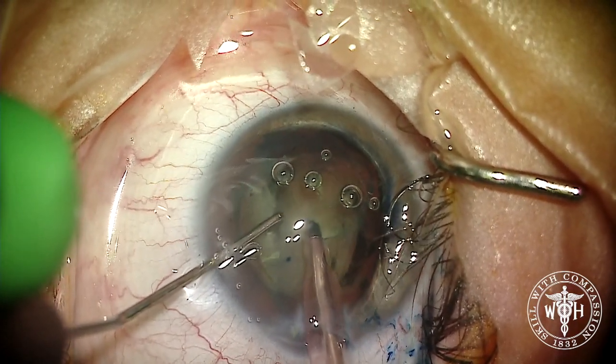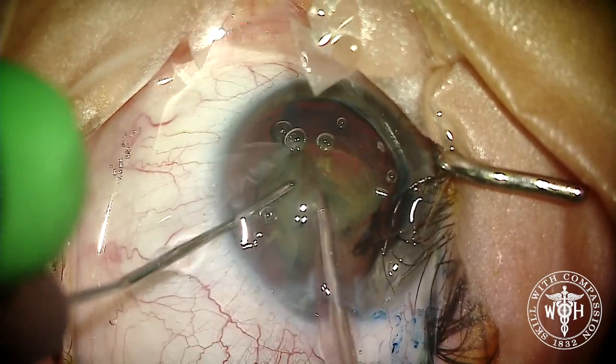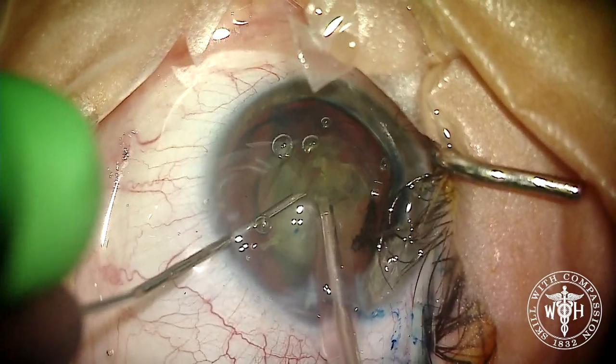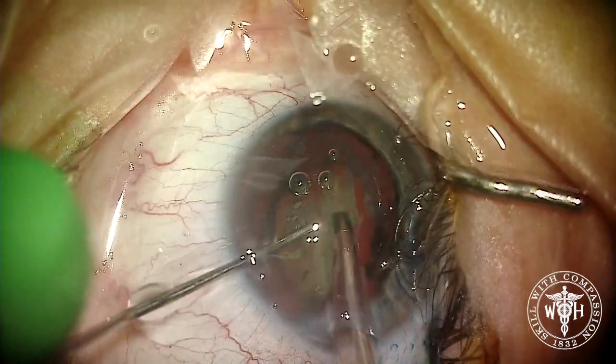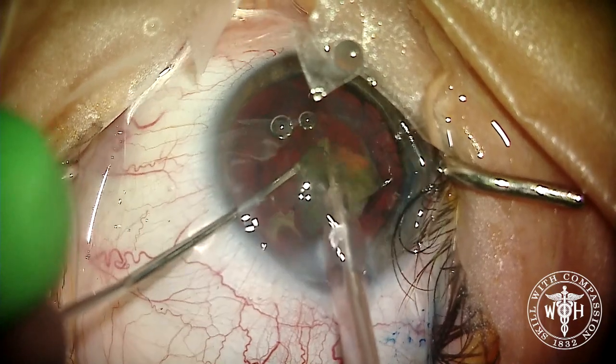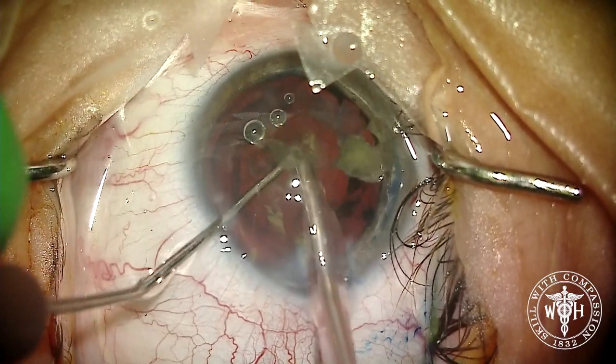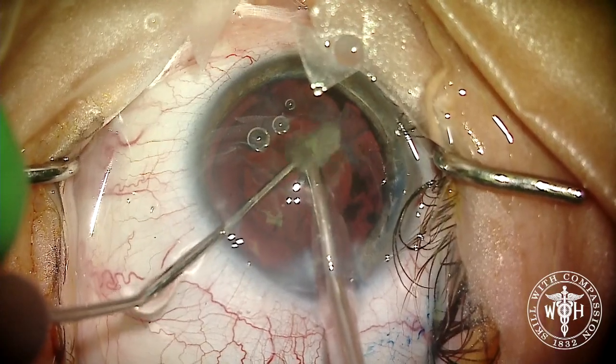Using slow-motion phaco with everything turned down, we're going to remove this cataract as efficiently as we can, trying to minimize not only our CDE but also the fluid flow in the anterior chamber. You can see those bubbles in the anterior chamber — they're not moving at all. We've got a good coating of OVD on that endothelium trying to protect it.